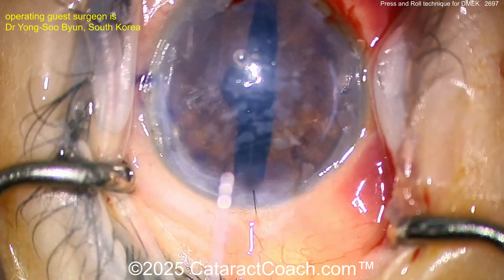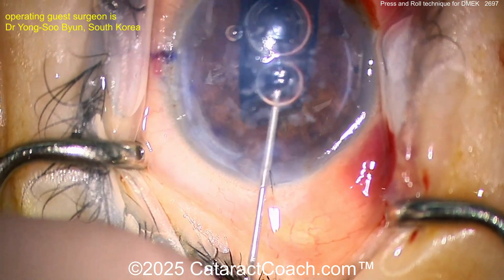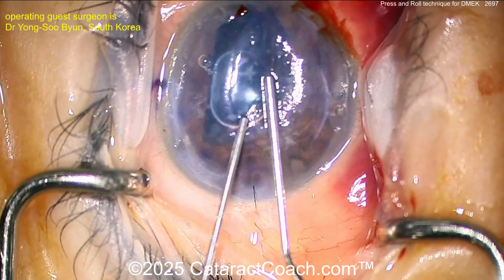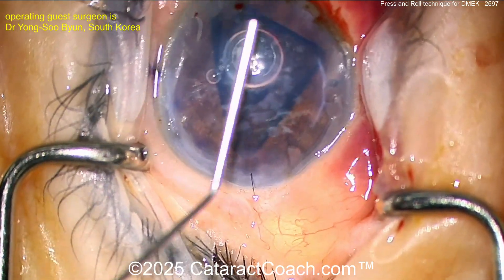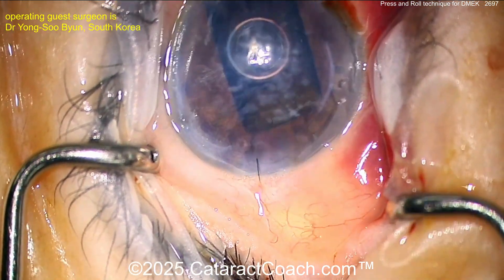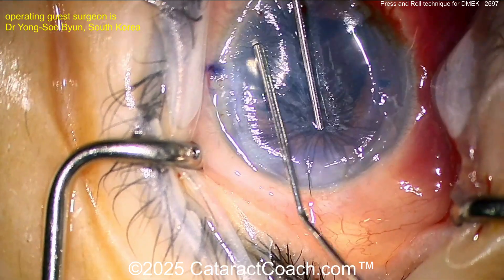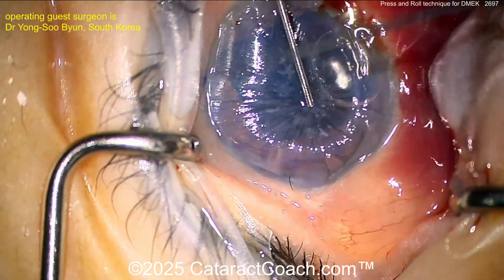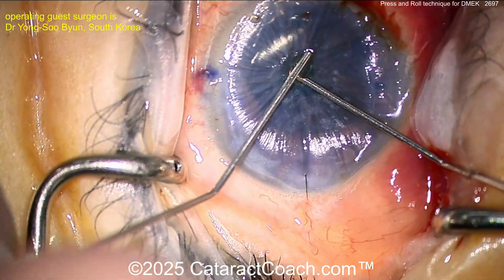With the graft in the correct orientation, an air bubble is placed on top of the graft — this is the press and roll technique. A small air bubble is used while pressing the center of the cornea down, then the bubble is pushed circumferentially to cause the graft to unroll and get into the right position. The bubble goes around and around — a very clever maneuver.